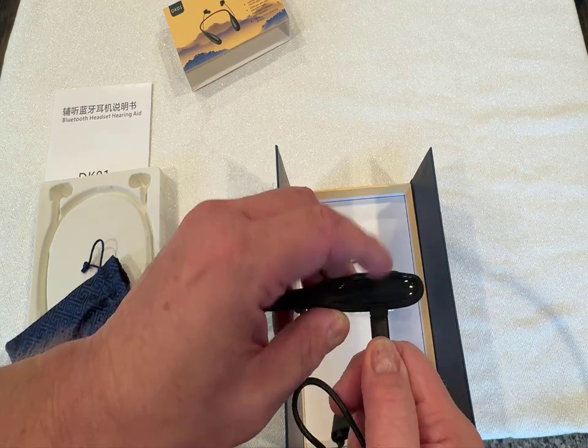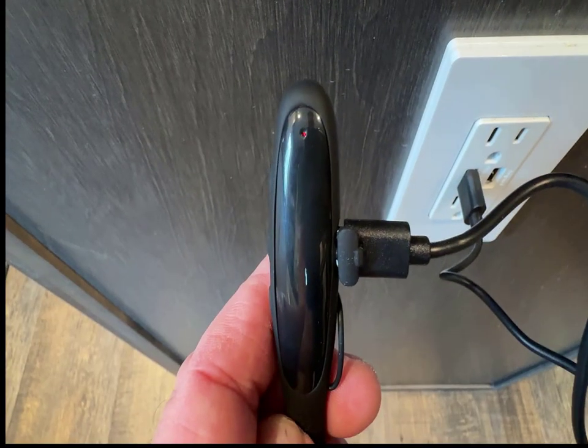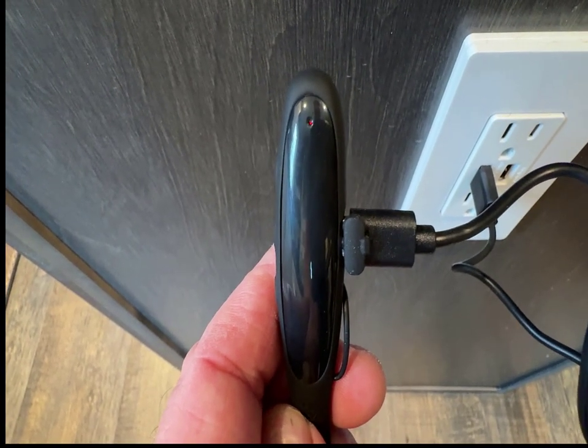Once plugged in, the red charging light will stay on until it's charged and then turn blue. Two hours of charging will provide 30 hours of operation.